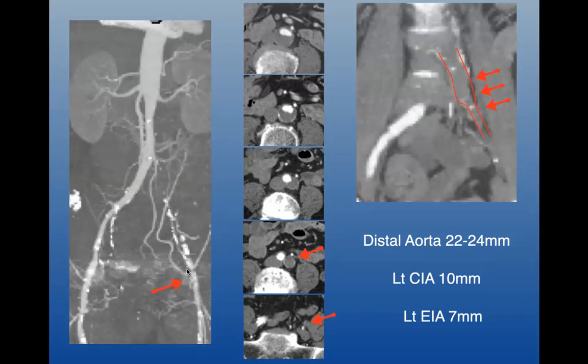The other thing I look at is the status of the common femoral artery. Is it normal? Is it abnormal? I actually knew by ultrasound that it was a relatively normal vessel without significant plaque. There was no significant narrowing. I knew that the deep femoral artery was also widely patent. And so I knew that I at least had a good landing zone here, in the sense that I would be able to stent down to here without covering this.